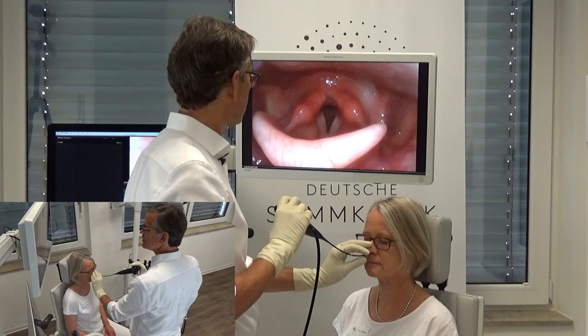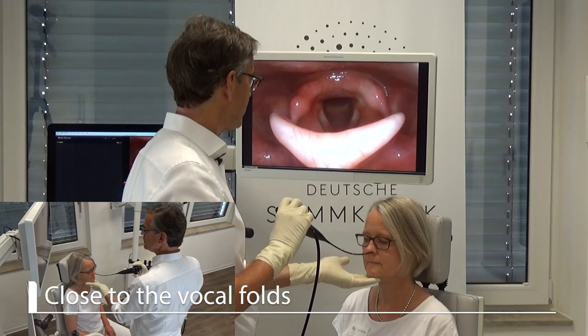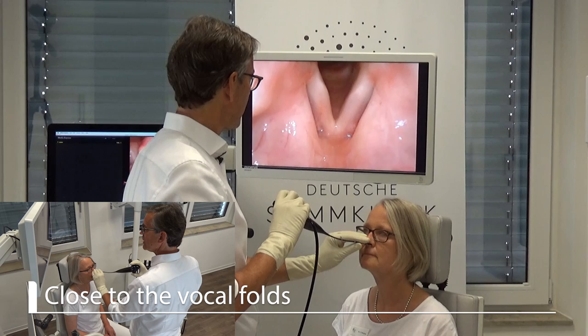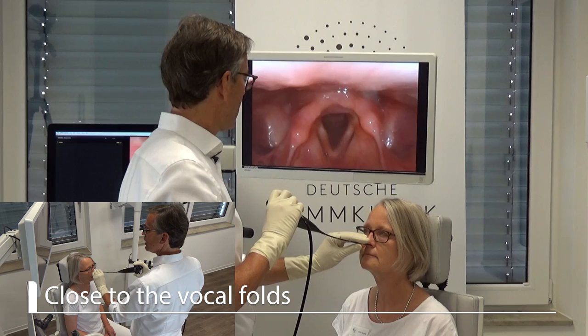Very nice. Now my intention is not only to see the vocal folds — lift your head a little bit — but also to go very close to the vocal folds. So if I just dip in, some patients will tolerate this and I can go very close and go back.